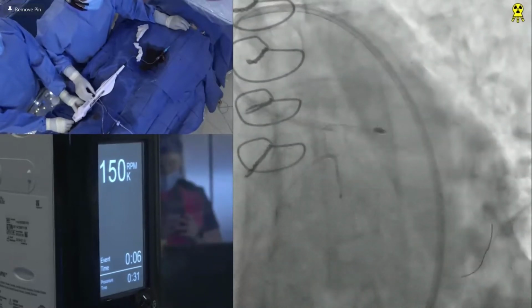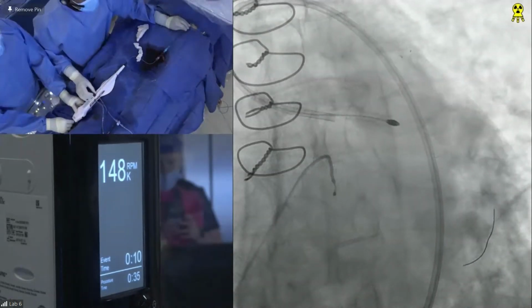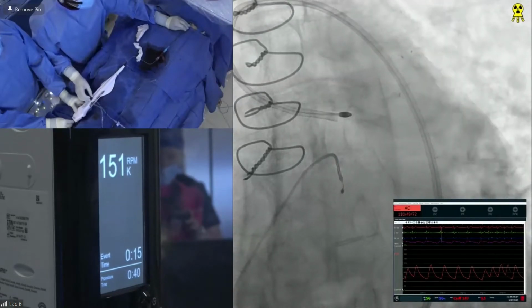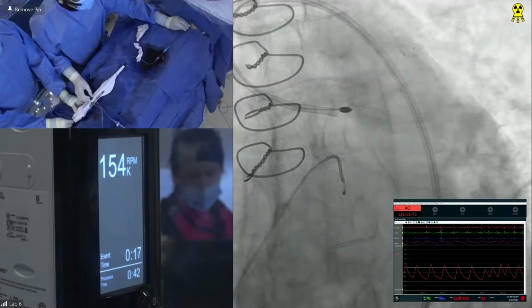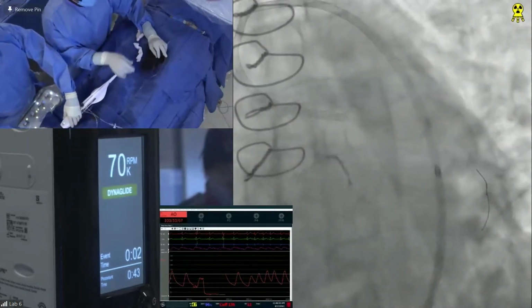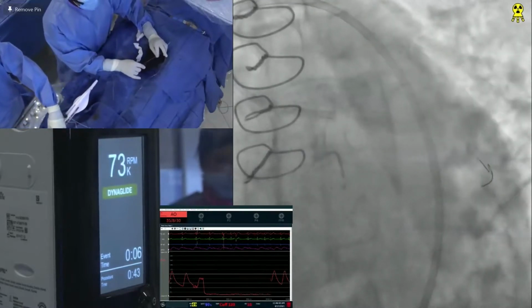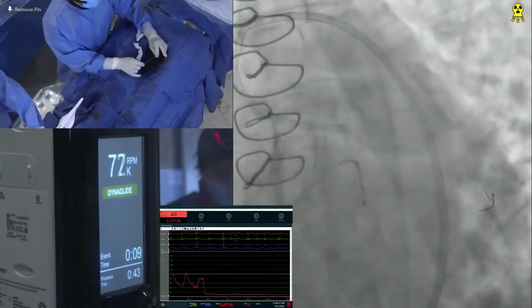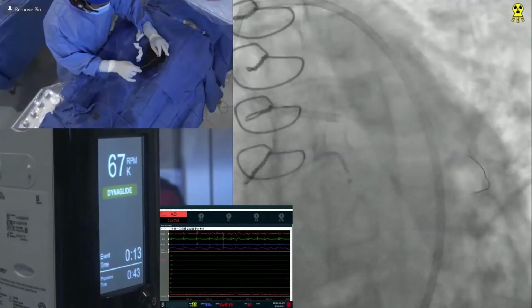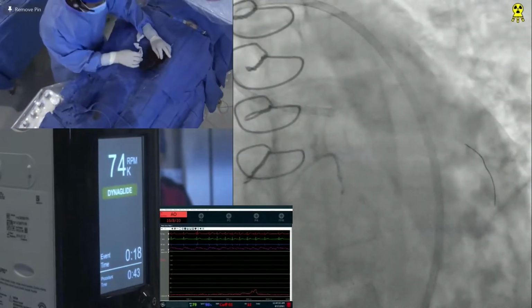Our goal is that most of our procedures are done with 150. You know the Rota Pro. I actually had a lot to do with its design. So now, when you start your rotablation, you start with 155. You can increase or decrease, but the company markets it with a 155 speed, which can, as I said, be increased or decreased.